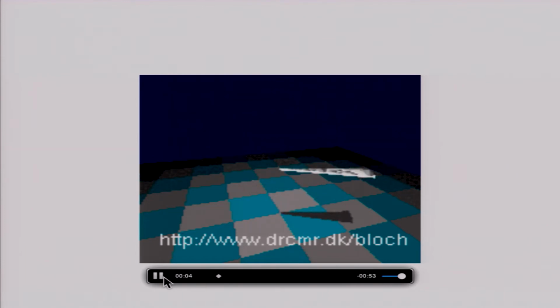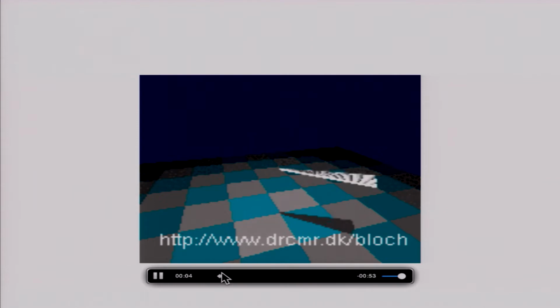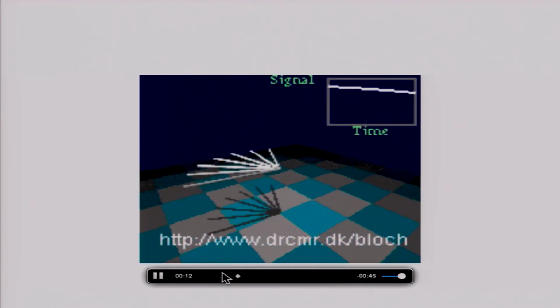Okay, so here we go. You notice what happens is there was a radio frequency pulse that was applied. And so here's the protons right now. They're all upright. And watch what happens as you apply this radio frequency pulse, which is that purple wave right there, it shifts the protons down now into the transverse plane. So this is when you apply a 90-degree pulse, you go from the vector being upright to being horizontal.